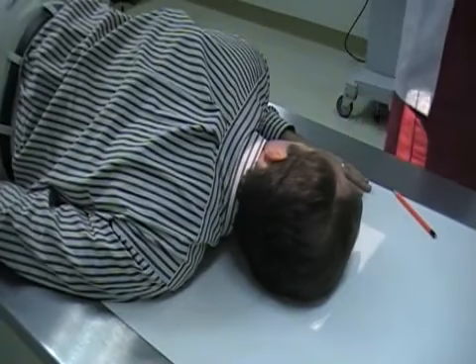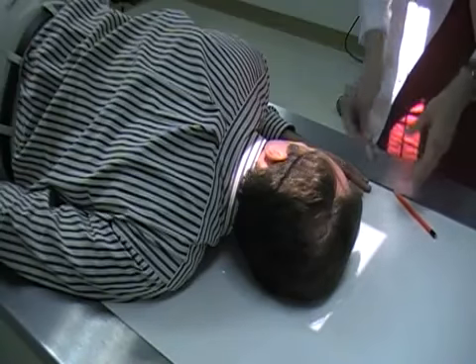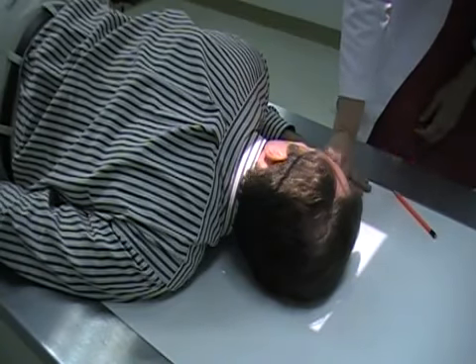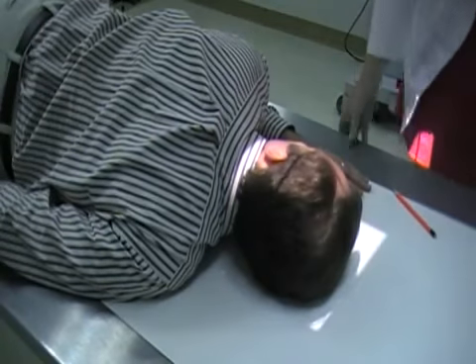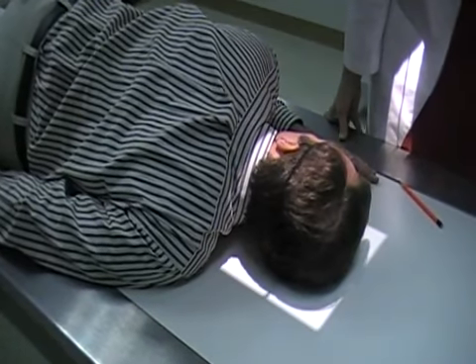So when we place our marker on, the right side is down, so we're going to mark it as right, and I like to put it right in front of the face. That way we know it will not be in the middle of the cranium when we check the exposure.